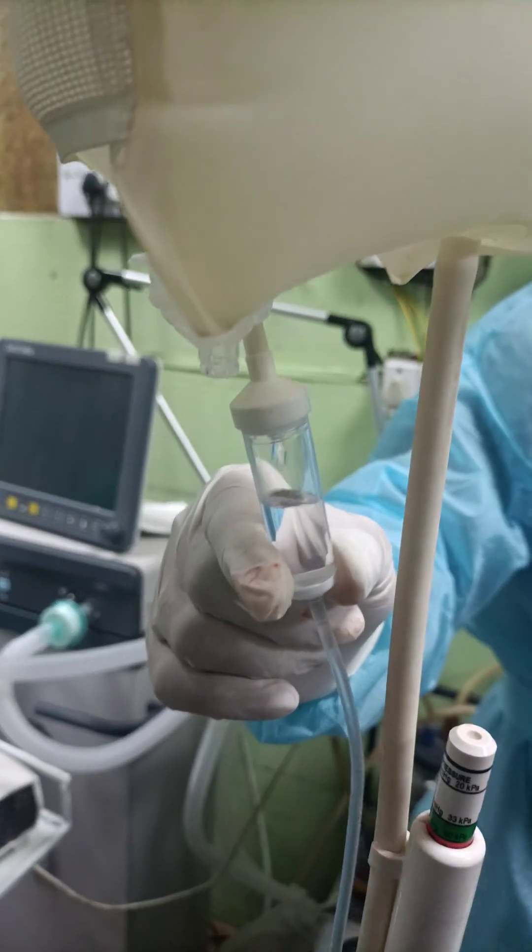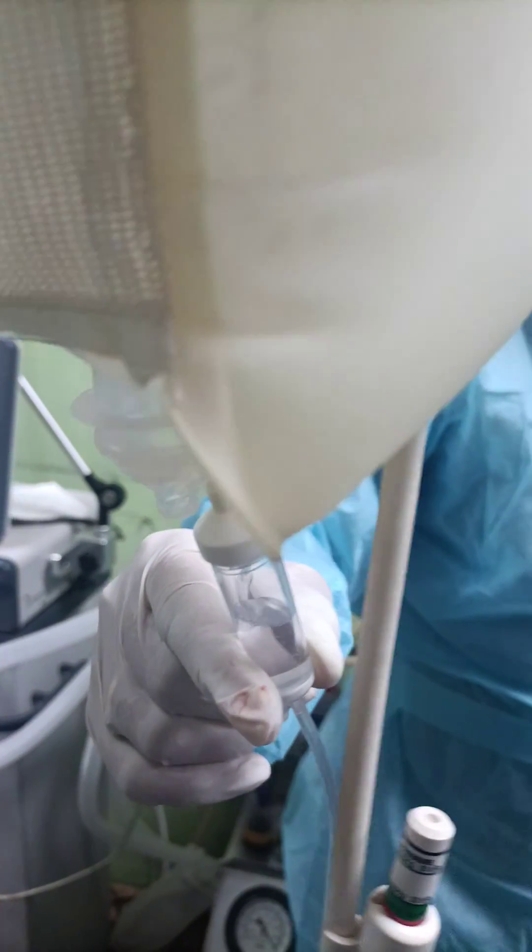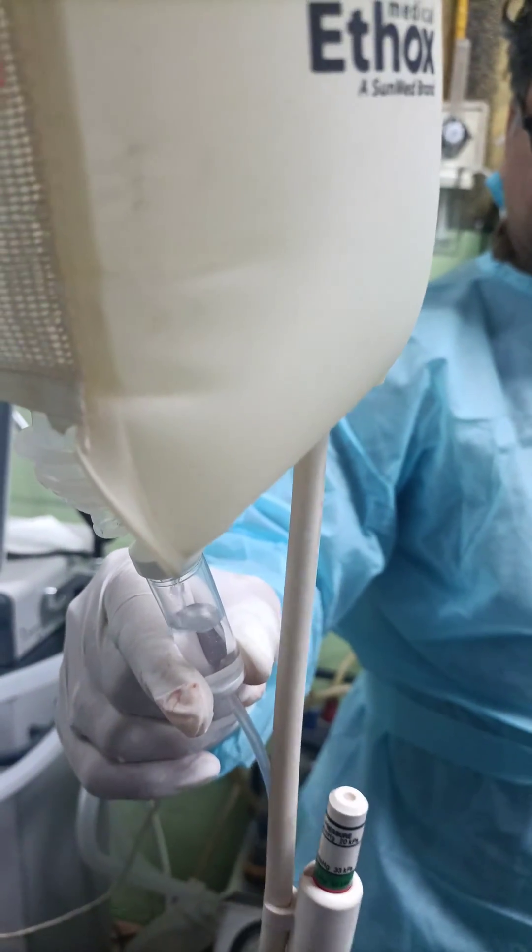Per hour — so IO access is very easy. It is required when you need rapid resuscitation and massive transfusion.